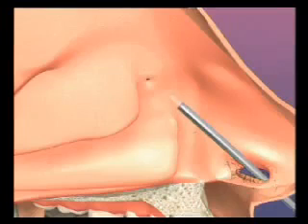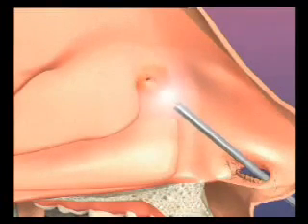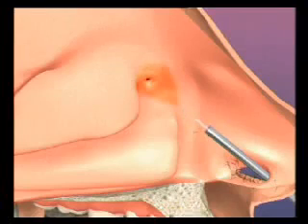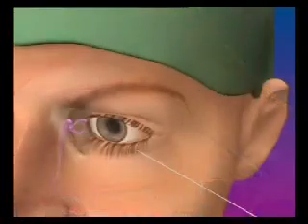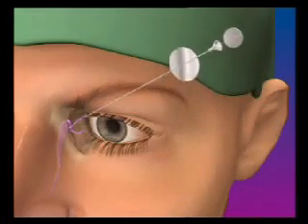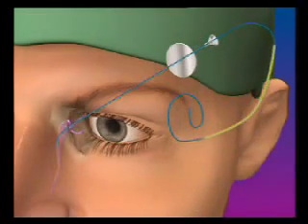The nasal mucosa is first coagulated with continuous mode laser energy and no contact. Then antero-inferior excision of the bone tissue in the ascending apophysis of the upper maxilla is performed with the laser in contact mode and pulses. Finally, bicanalicular intubation with PVP-coated silicone tubing and proline thread is carried out, aided by the guide wire.